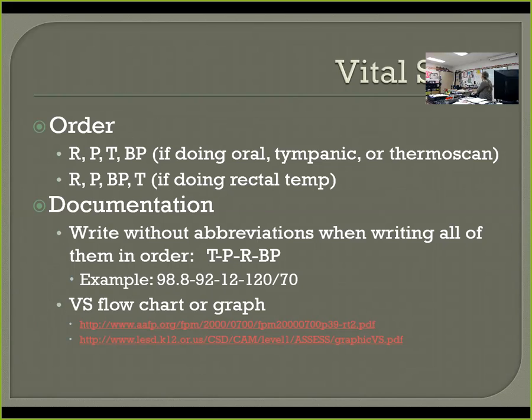And so, same idea here. When you're talking about taking somebody's vital signs, you go least invasive to most invasive. Think about even taking it on a child. The scariest thing to a child a lot of times is blood pressure, or it could be temperature. But those are going to be the most uncomfortable. So I don't want to do that first, or they're going to get all worked up, and then how am I going to check their respirations and their heart rate if they're crying and out of control? It's the same thing. So least invasive to most invasive.